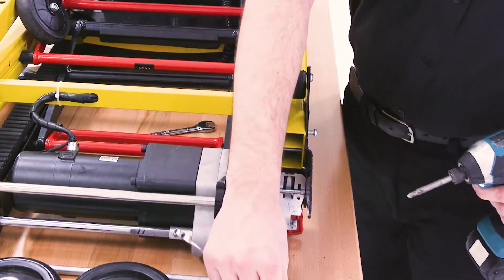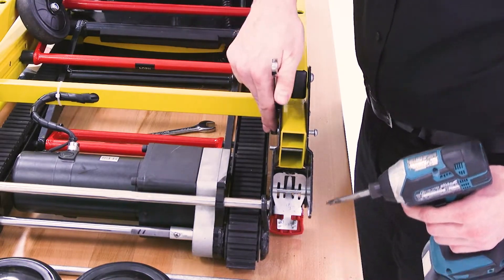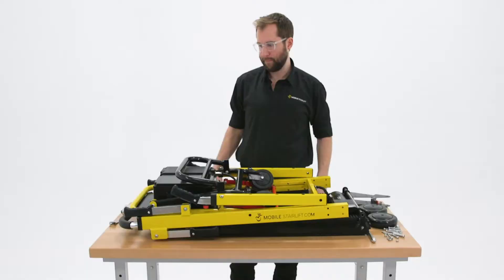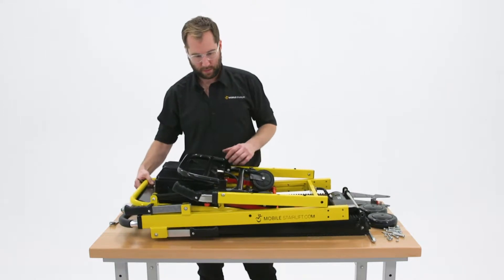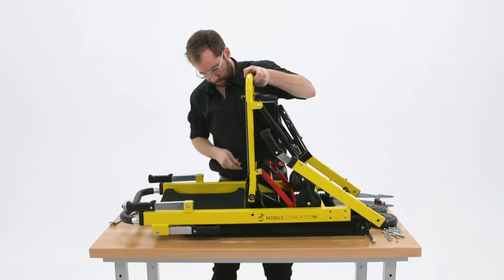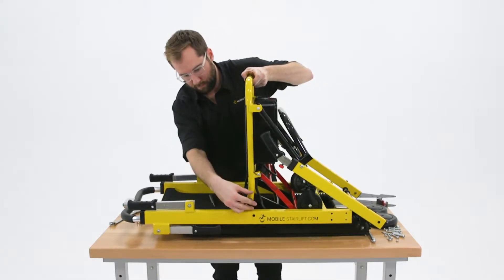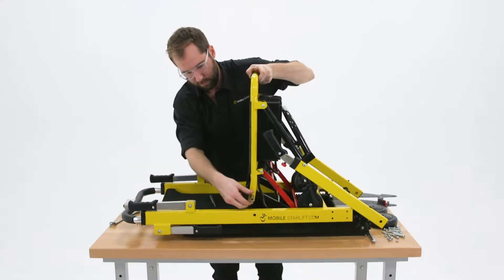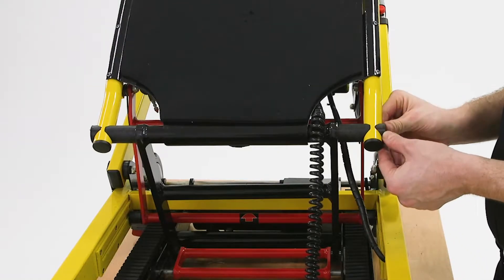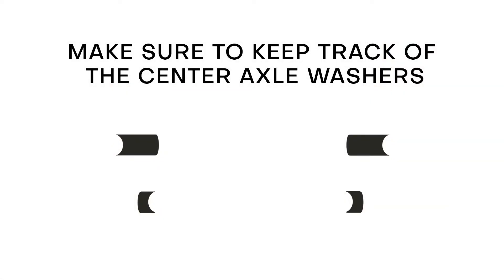The second bracket may now be removed by following the same steps and removing the four smaller bolts and the one larger bolt. When you have finished removing the second bracket, fold the seat of the stairlift up until it is perpendicular to the frame of the chair. Use the punch to drive the center seat axle out of its housing and then pull it completely out the other side. Make sure that you keep track of the four black plastic washers which fit between the seat and the main frame of the chair.